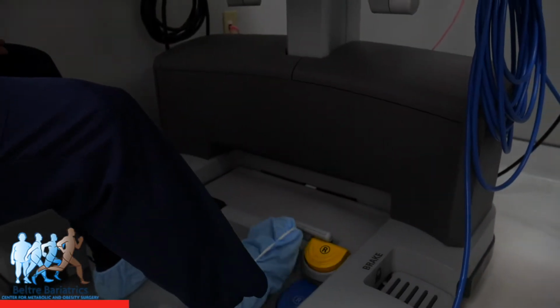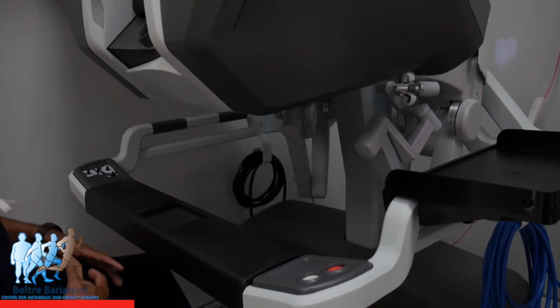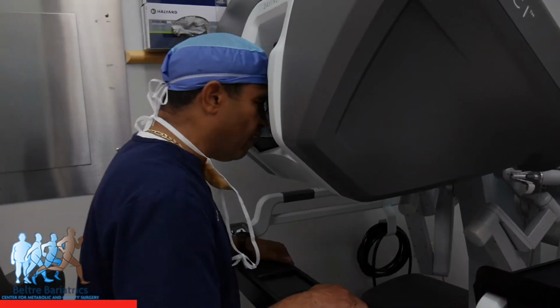I can work the staples from here, the cautery, and so on, the camera. When I'm sitting, I'm actually looking through these visors right here.